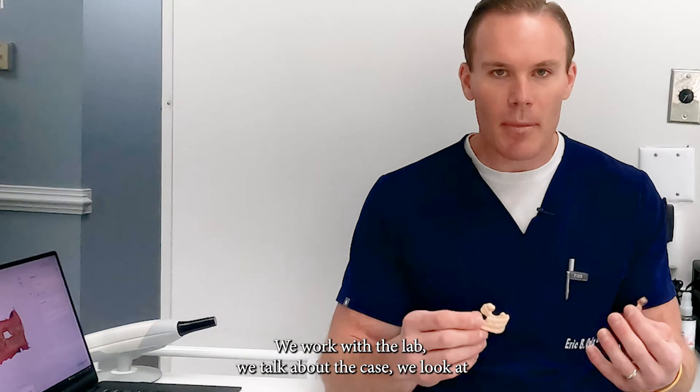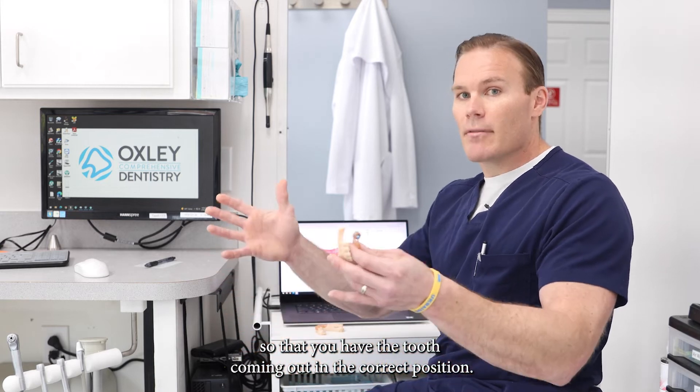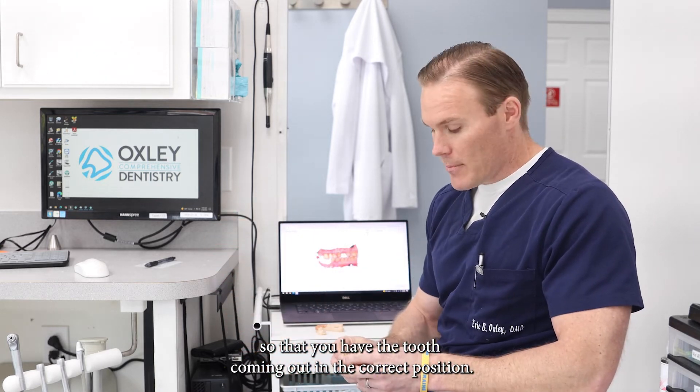We work with the lab and talk about the case. We look at where we want this dental implant to go so that you have the tooth coming out in the correct position.